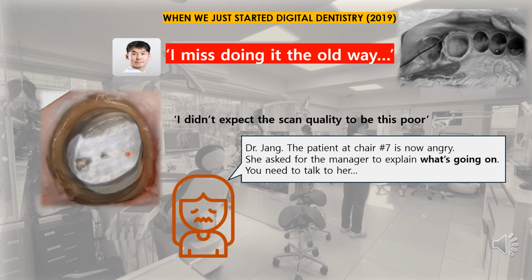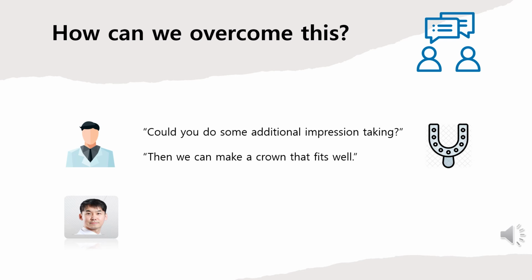This was because with a stone model, I could easily diagnose fitting issues through physical trial. But with modeless crowns, since I received only the prosthetic, it was difficult to pinpoint the problems. To fix this situation, the director of the dental lab suggested taking another impression. He was sure that in doing so, I would be able to make well-fitting crowns, just like before. But I was opposed to this, emphasizing that we should adhere to the digital workflow.